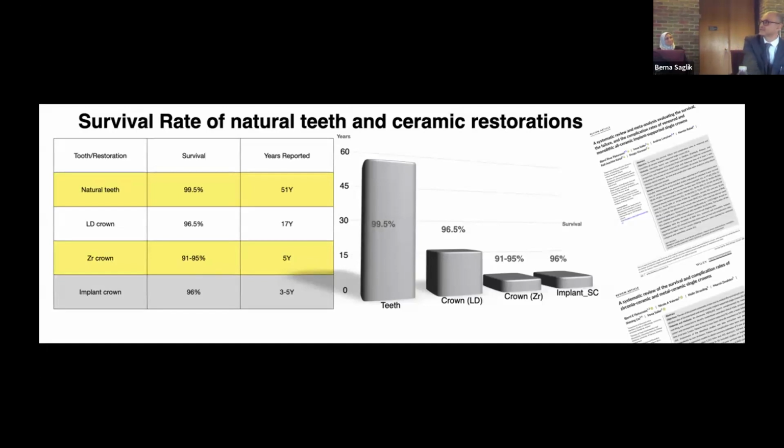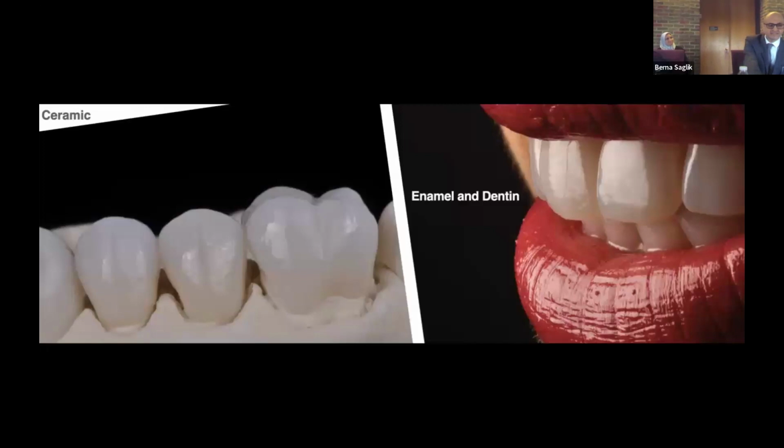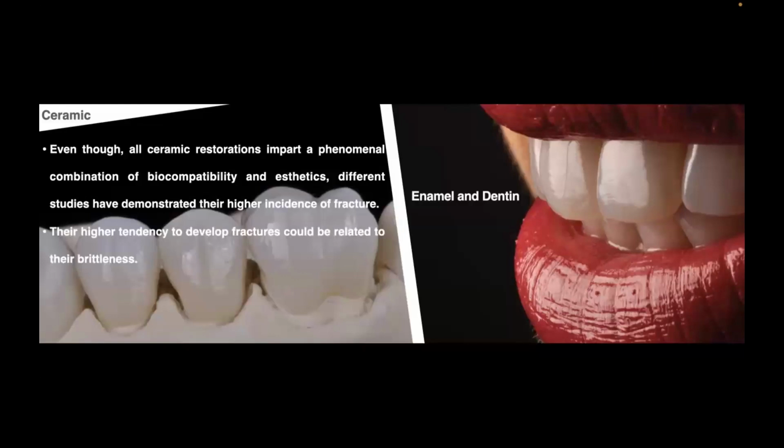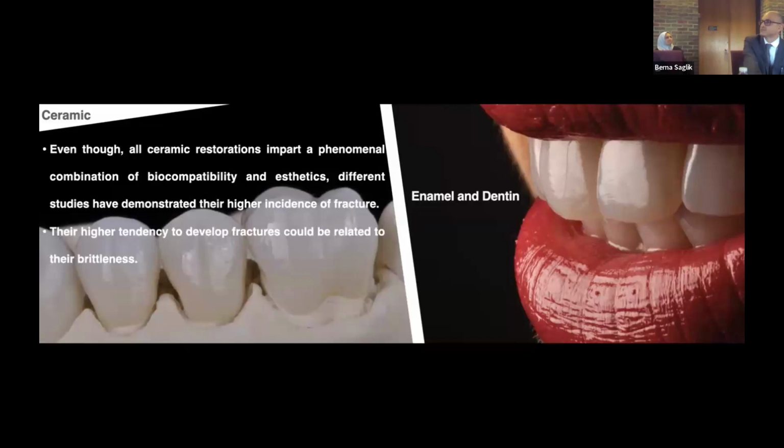I think that you are going against nature. Your enamel and dentin have properties that you don't pay attention to when you create a ceramic restoration. Your enamel and dentin is a graded structure. Did you know that, right? Your dentin has a low modulus of elasticity, low hardness, and lower flexural strength too. Your enamel is hard. That's it? This is what most dental material books talk about, but that's not the fact. It's more than this. Your enamel by itself is a graded structure.